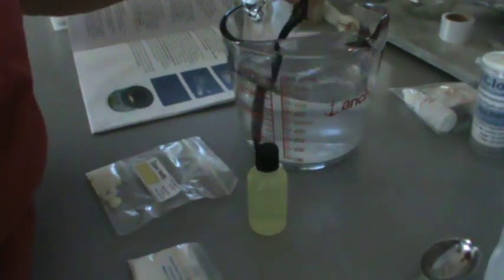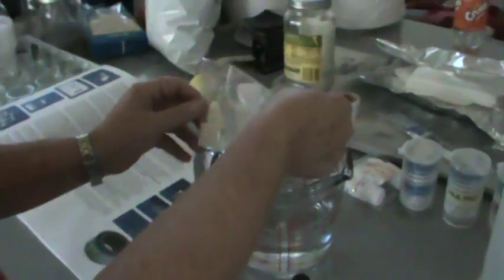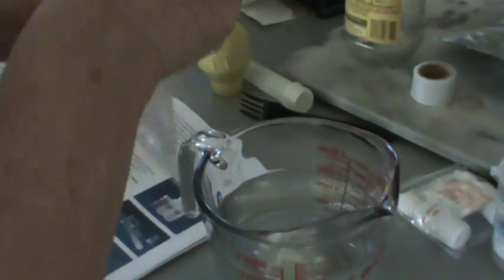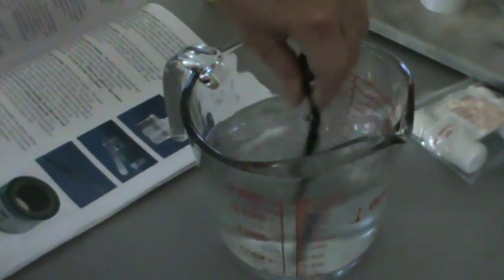It's almost completely dissolved and now we've got it completely dissolved. Now I'm going to use the base medium with vitamins — that's going to go in next. It's kind of clumpy. I'm going to take a little bit of this water to rinse it out so that I know I have everything that it needs in there. Let's stir that up. That dissolved pretty quickly.